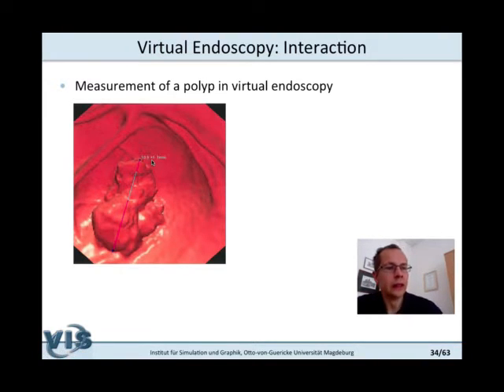measurement. Yeah, there are different sources of measurement uncertainty, but one that you can really reliably take into account is the spatial resolution of the data from which this visualization was created. Yeah, so at best you can select the right 2 voxels from which you want to compute the distance, and then the uncertainty is the size of a voxel. That is basically the diagonal of this voxel, and you have this uncertainty both for the start voxel and the end voxel, and that leads to this plus minus 1 millimeter.